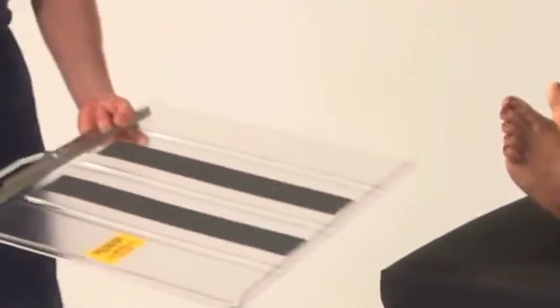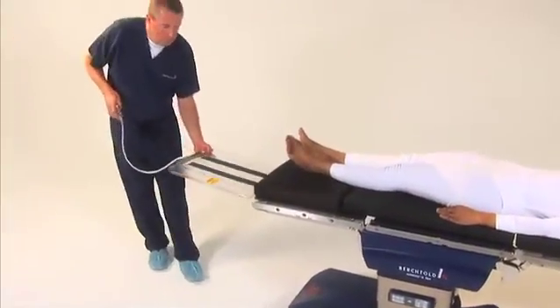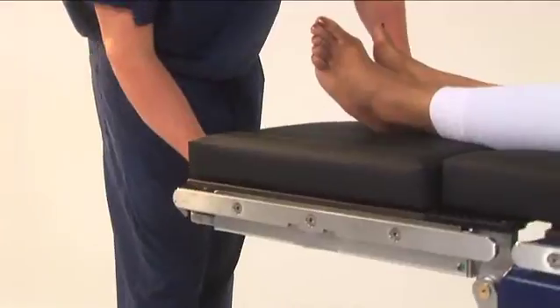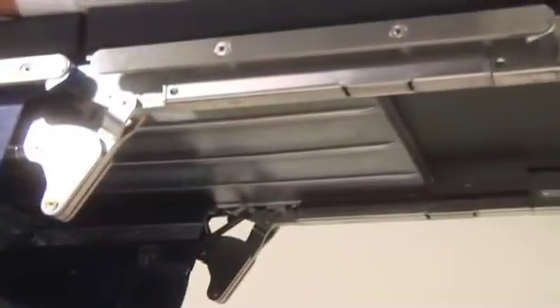When preparing for imaging, place the film inside the X-ray cassette holder. The cassette holder can be introduced at the head or leg section of the table by sliding the tray onto the integrated track. By pulling back on the attachment cable knob, the cable becomes taut and allows the caregiver to slide the cassette the full length of the table.